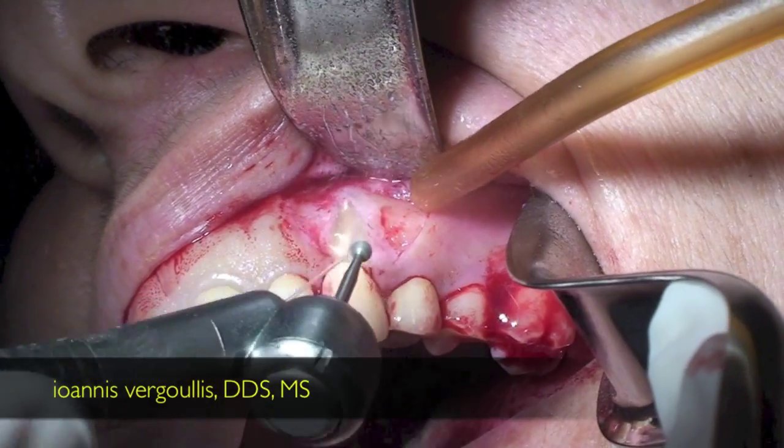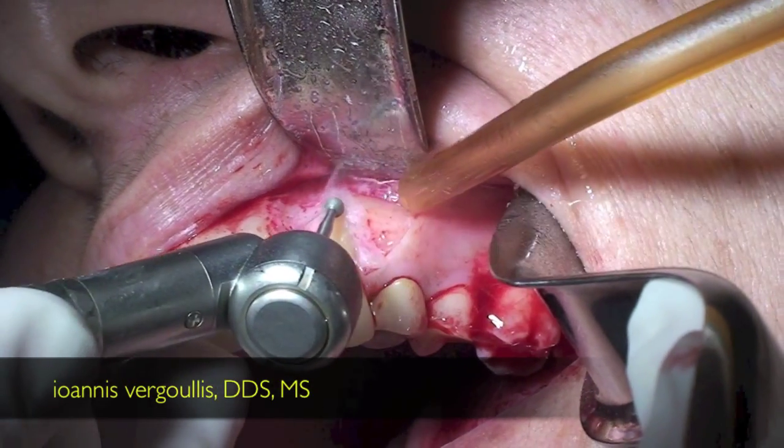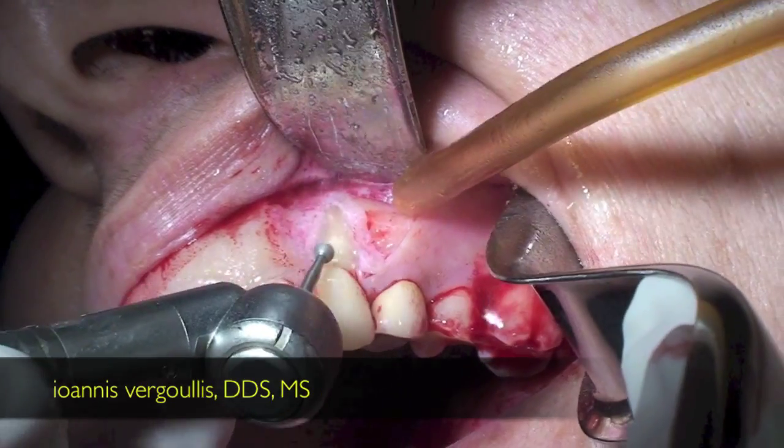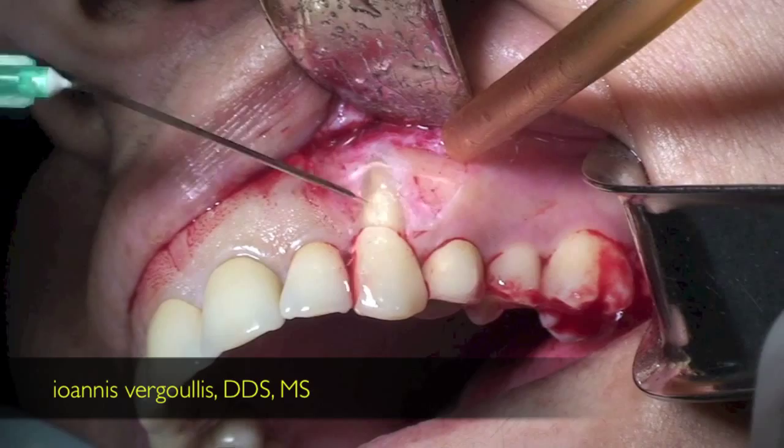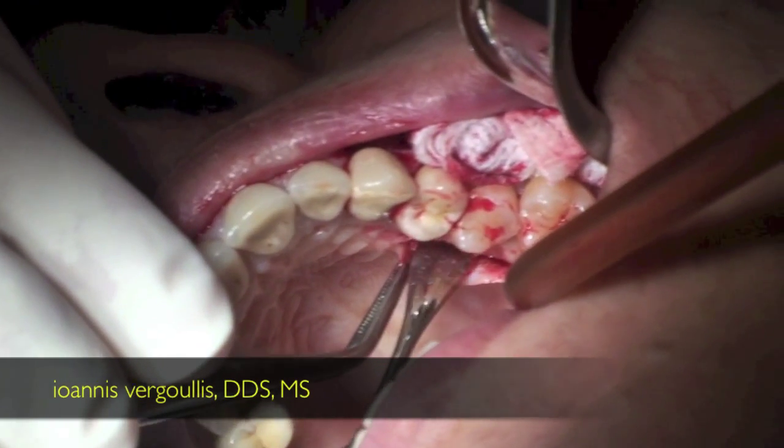We do rootplasty and we remove any root prominence and flatten the root completely in order not to have any irregularities. We treat the root with tetracycline and rinse with saline solution.